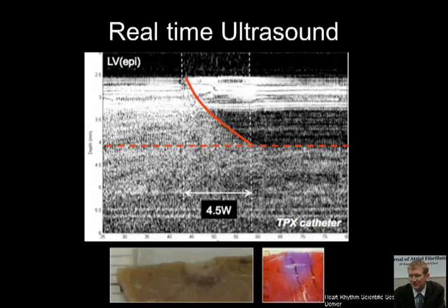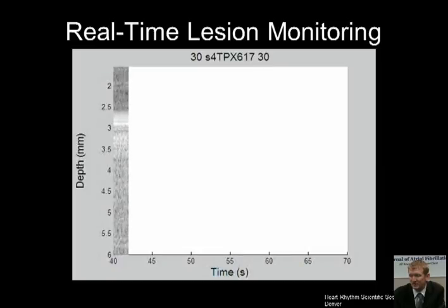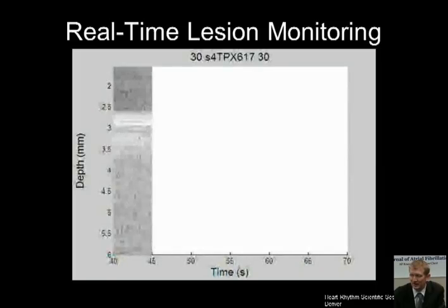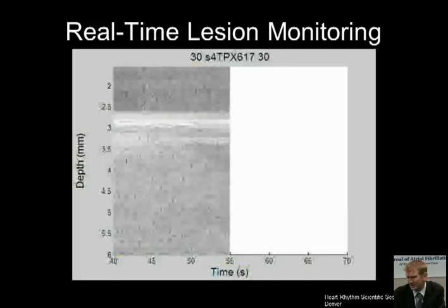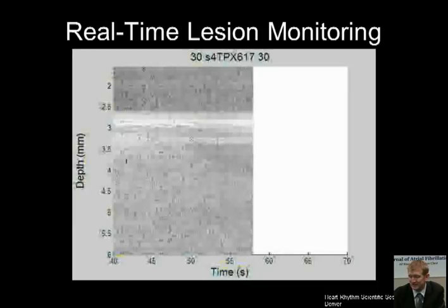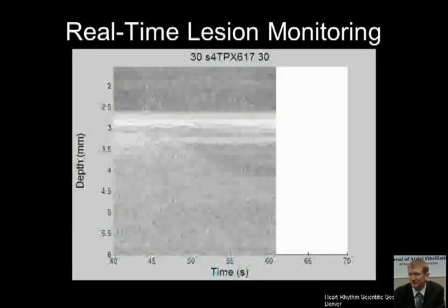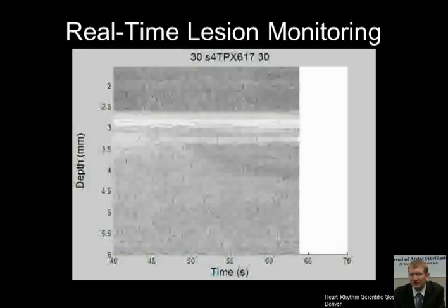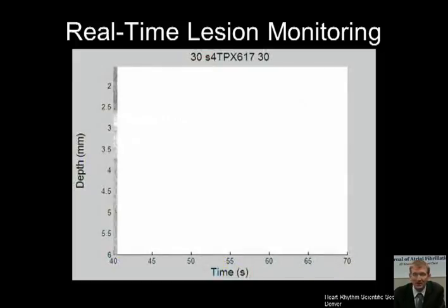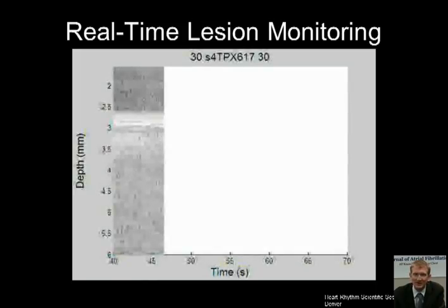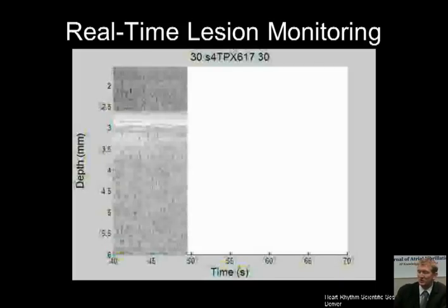Here is what we see in real time. At about five seconds in, the power is started. Then gradually, as time progresses, you'll see a very subtle change in the ultrasound contrast where it goes darker and darker, reaching a plateau at about 15 seconds into the ablation. You can see that on the left-hand side of the panel the contrast is uniform, whereas on the right-hand side there has been a clear change, and this is due to tissue necrosis.